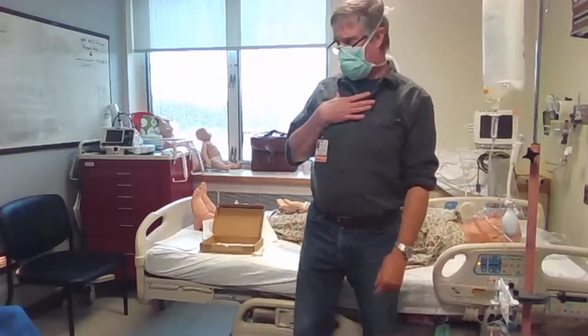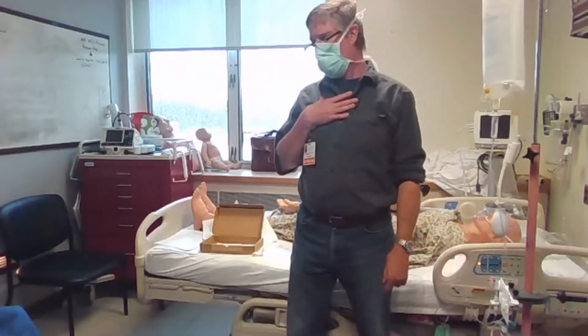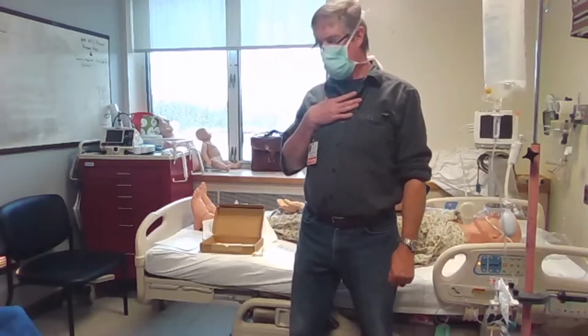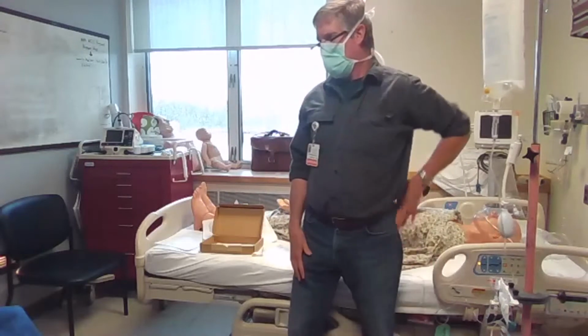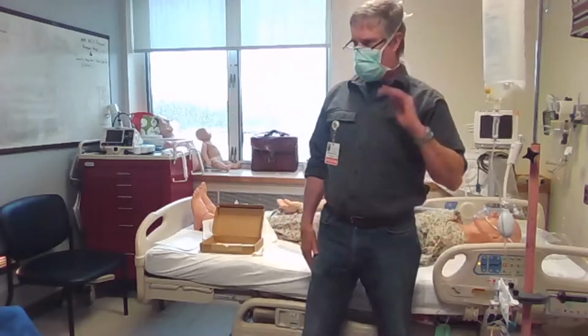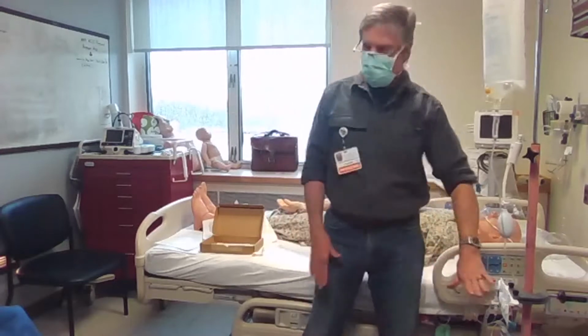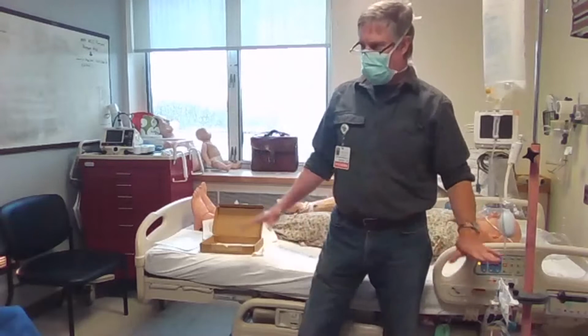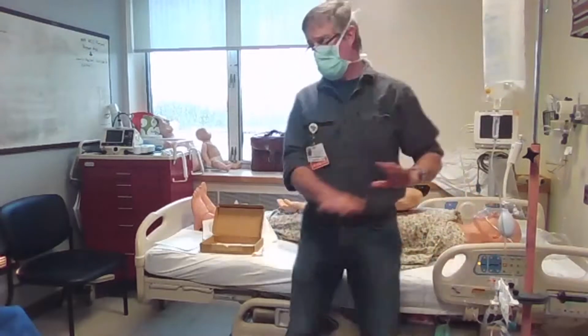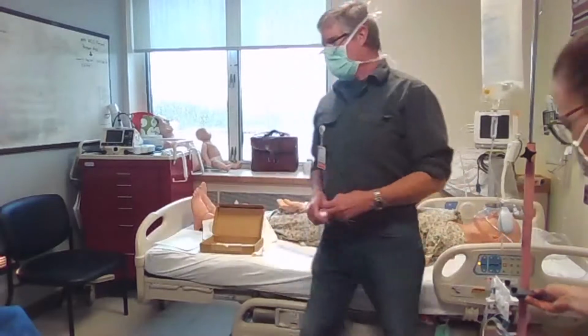So even if you level those both out, you've got to still zero it at every single atmospheric pressure where you set it. So every time you have to move it, you have to re-zero it. But the arm taping thing is a good idea.